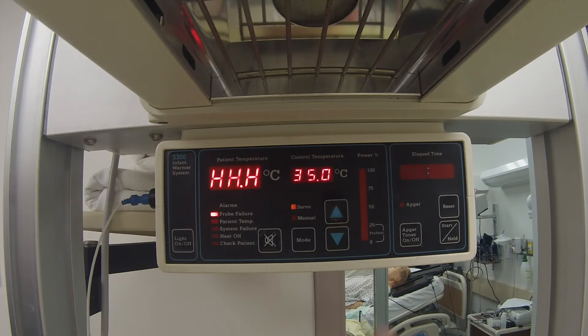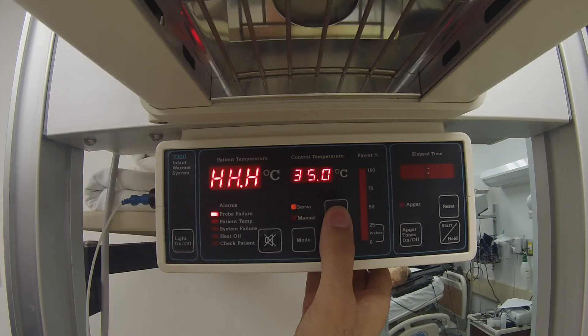Servo temperature can be set to a range between 35 and 37.5 degrees Celsius.